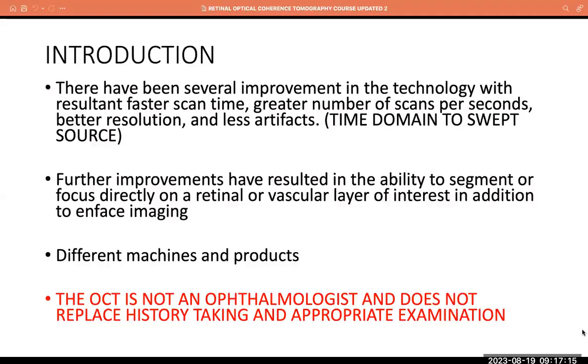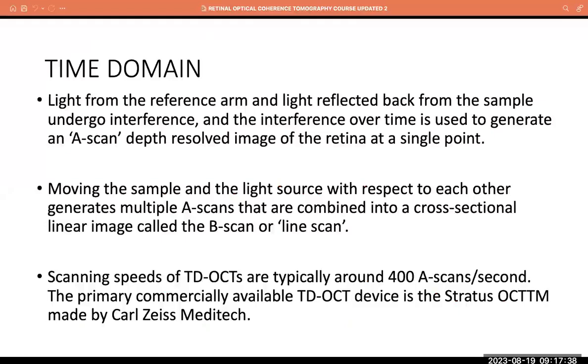You, the physician, you, the ophthalmologist, are going to interpret the OCT on the basis of the history of the patient, the examination findings, and in most instances, you must have a fundus photograph, because your fundus photograph will guide what you're looking out for in the OCT and where you place the OCT and what you intend to do going forward, because several conditions, macular edema, for example, can be from anything.